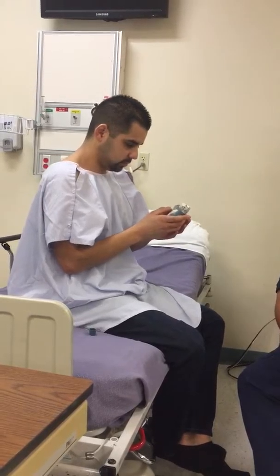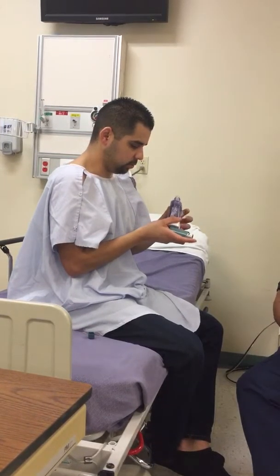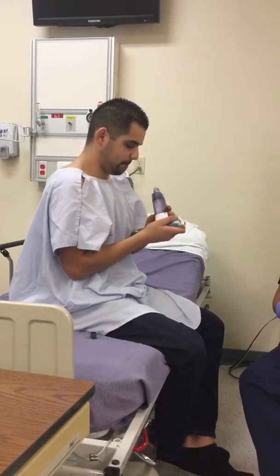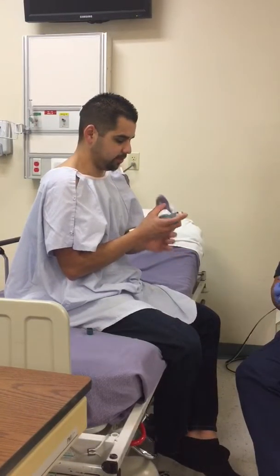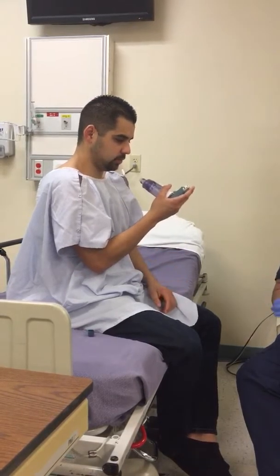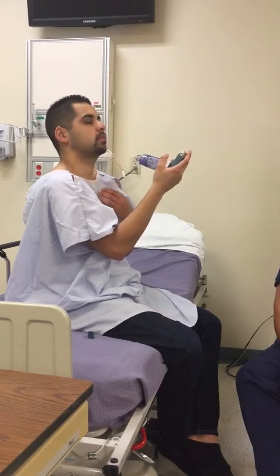All right, now we'll be doing this again. We'll just wait about a minute. And then if I inhale too hard, it whistles. It will whistle, so it'll tell you if you're breathing in too quickly. Okay. So then I wait about a minute between puffs. And then I do it again. Exactly. So you can go ahead and do it. Exhale. Tilt my chin back.